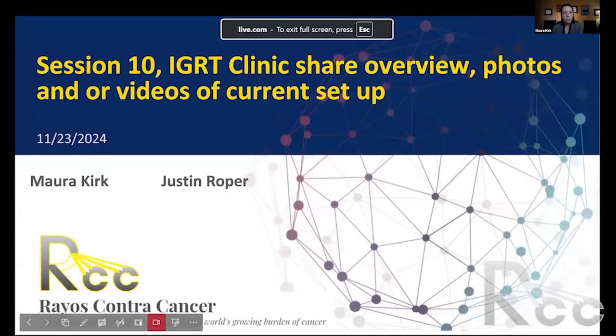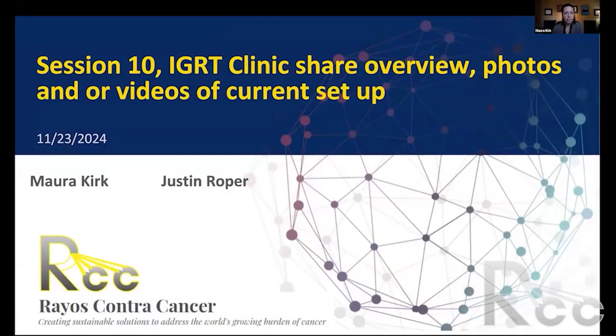So welcome to session 10, IGRT clinic share overview. Let me share photos and videos of current setups. What we're going to do is kick it off by going through different devices that you can use for setup, and why it's important to have a good and reproducible setup for our patient, minimizing motion and intrafractional differences.